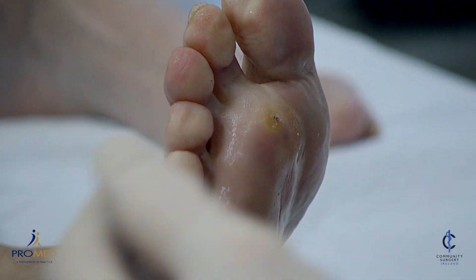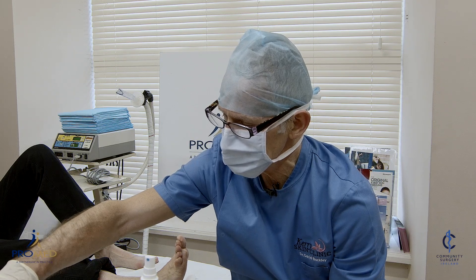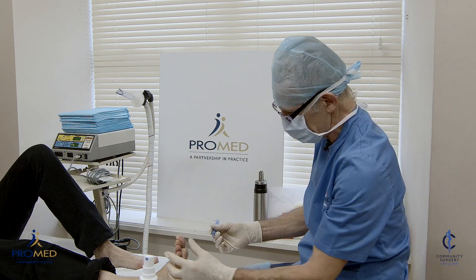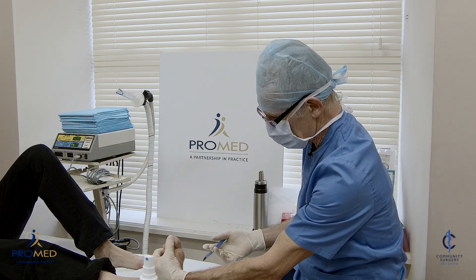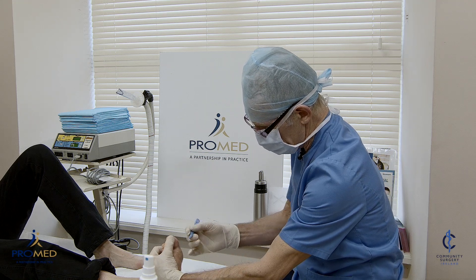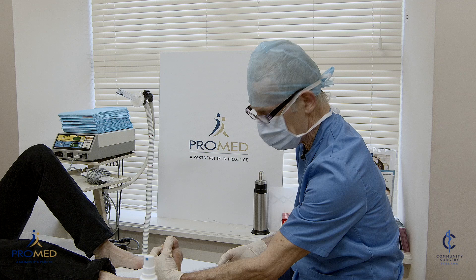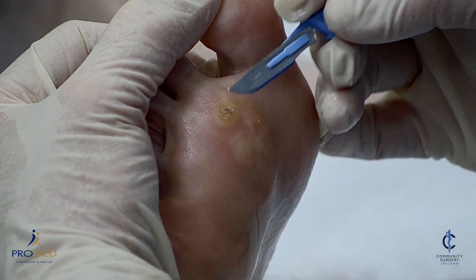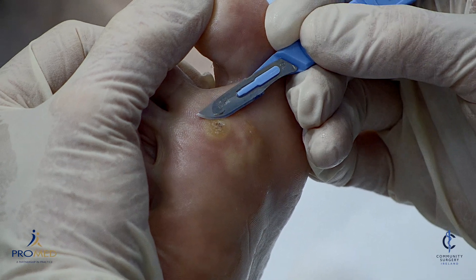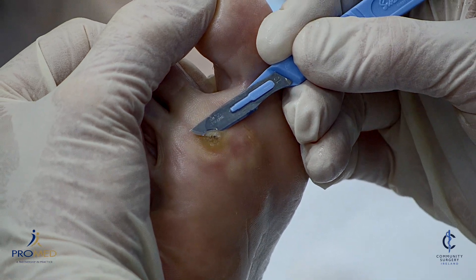You can use home treatments like salicylic acid — paring it down, putting it on every night — but that takes six or twelve weeks and most people don't have the patience for that. So if that doesn't work, then obviously cryosurgery is the treatment of choice. You have to make this as painless as possible and you have to debulk. You have to be absolutely sure of the diagnosis, but there's no question here — this is a plantar wart, there's nothing else it could be.